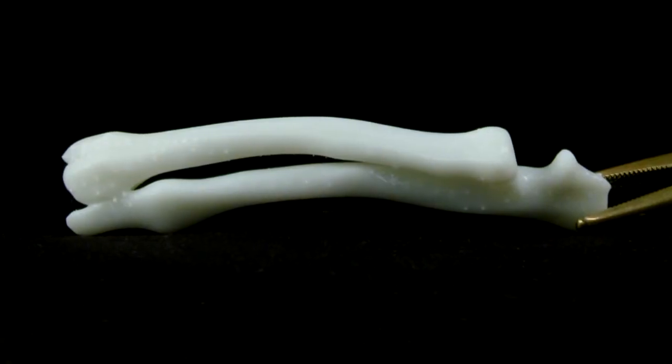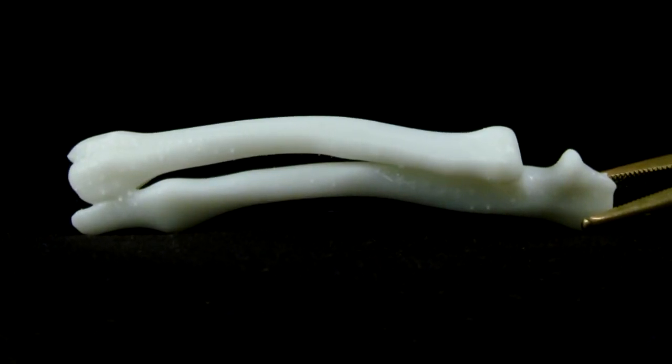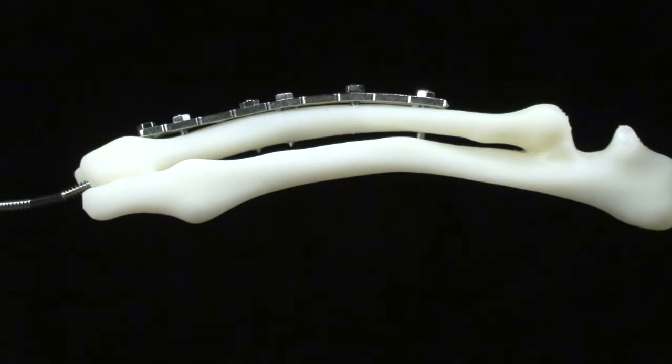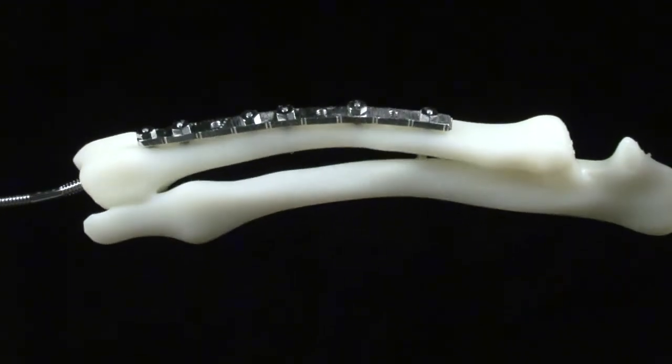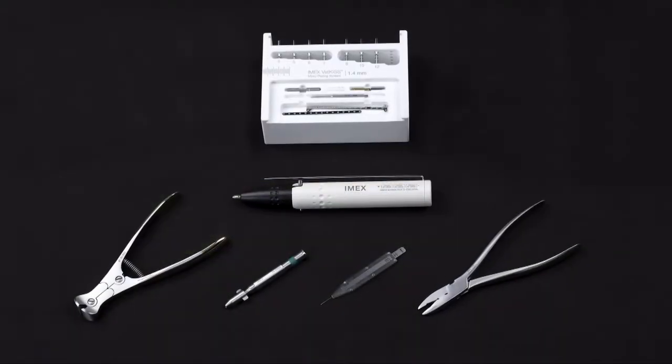This tutorial will demonstrate proper use of the VetKiss instruments and proper implant application to a plastic bone model. This exercise will utilize the 1.4 mm implant set and a pre-contoured 1.4 mm straight plate.